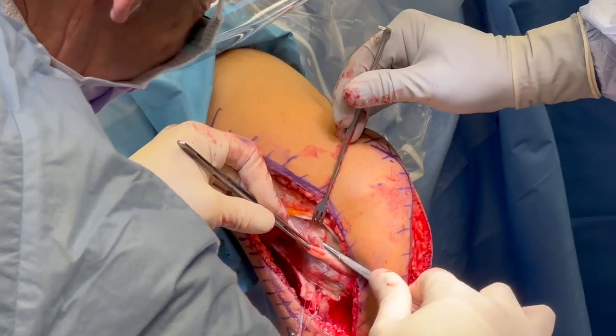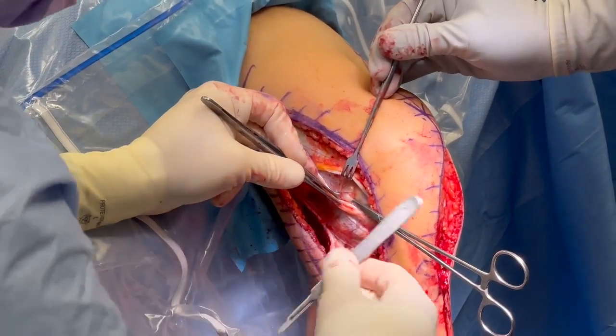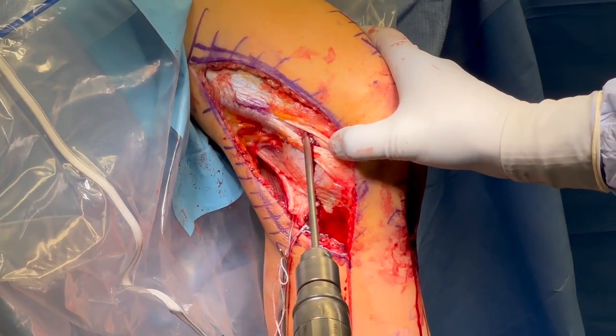The iliotibial band is split and the location of the FCL attachment on the femur is identified using the traction stitch. A guide is used to drill a guide pin through the femur that is over-reamed with a 6 millimeter reamer followed by a 7 millimeter tap.